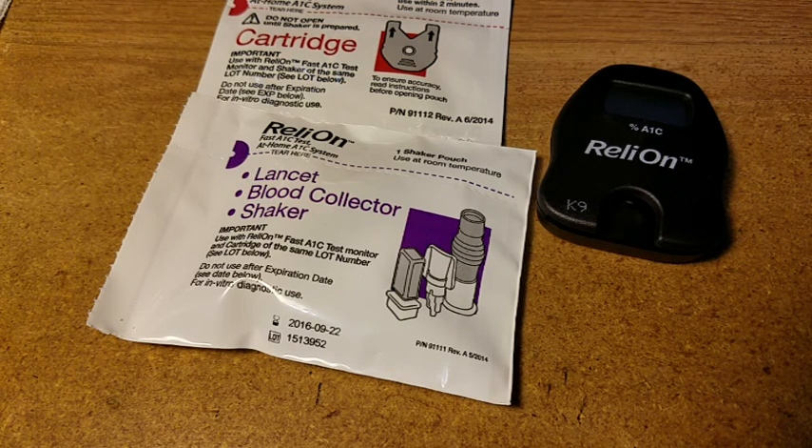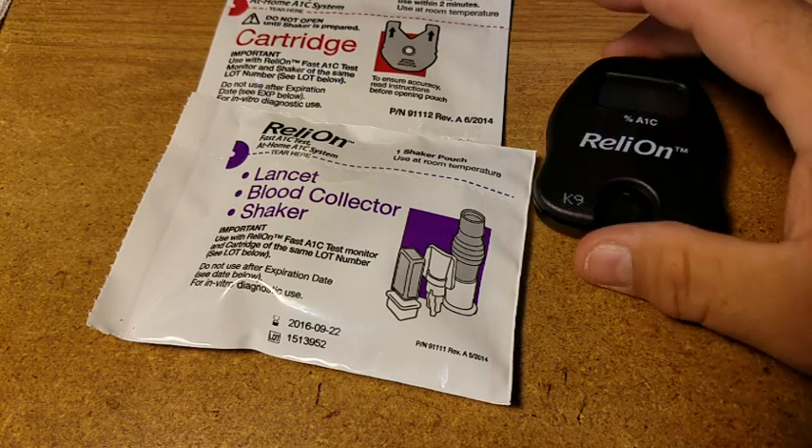Our last A1C test was a 10.2. So let's go ahead and do this.